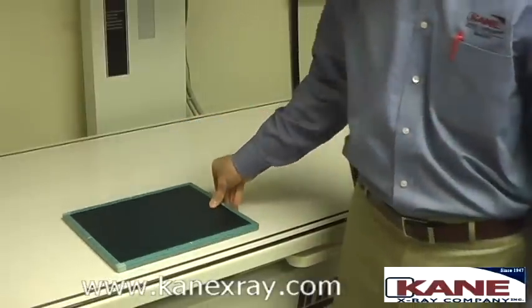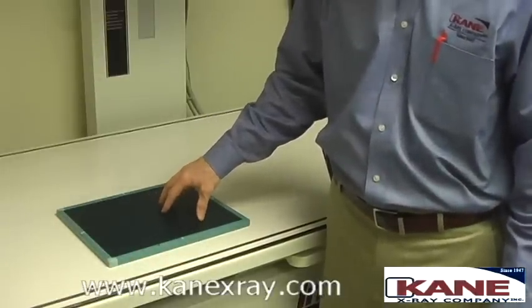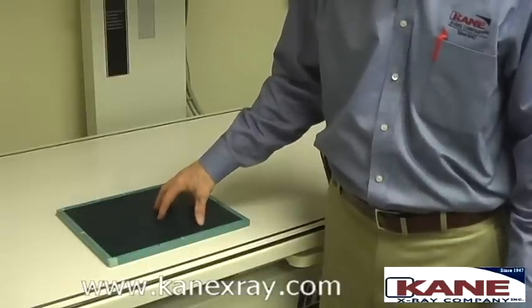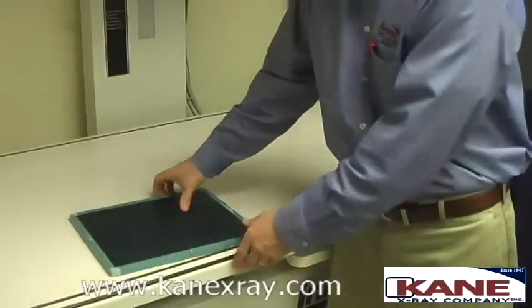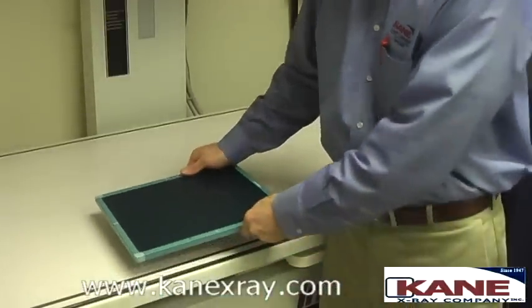When doing tabletop exams, there is an option to use a plastic bag that's radiolucent to protect the cassettes from any fluids or trauma that might occur on the tabletop. Doing under the table exams, the bags are not necessary.